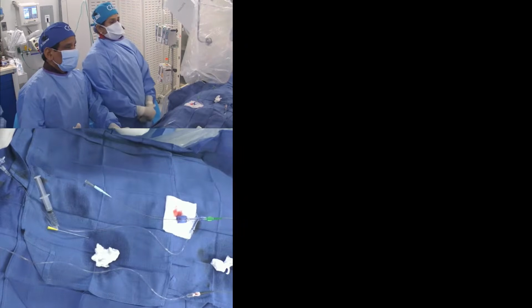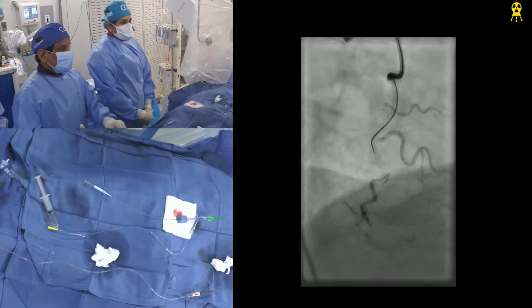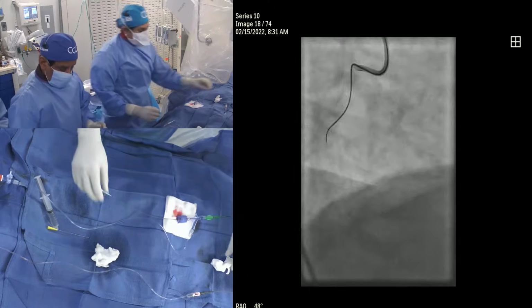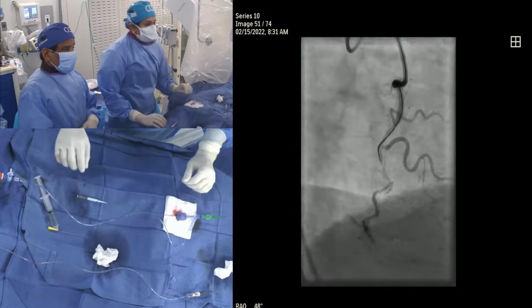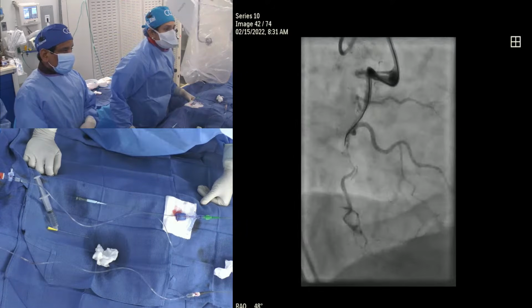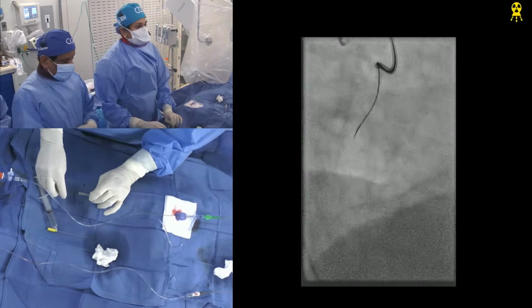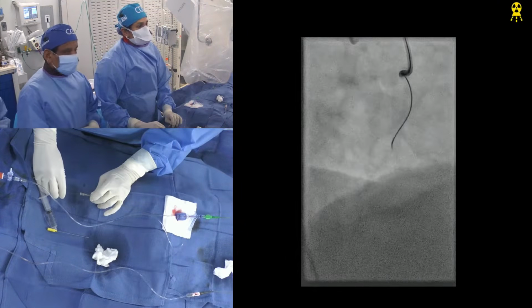So this is poor man's IVUS. You see this? What I'm saying is, when you bring your shutters in, not the lung shield, just the shutters, we are subintimal. Yeah. Okay, get the Gaia. Right here.